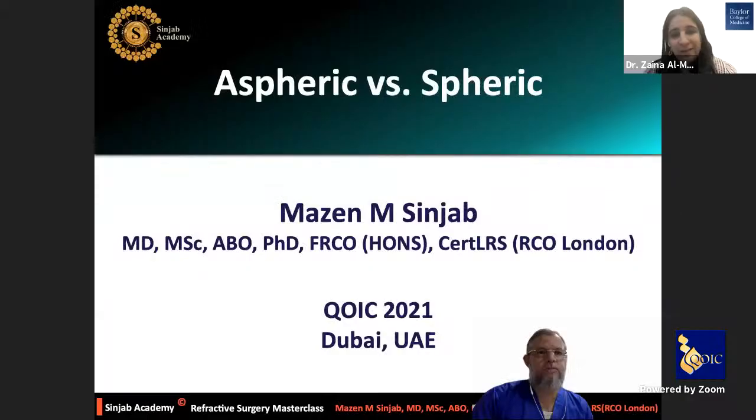Sure. So the power. We've looked at different studies to compare if you use total corneal astigmatism versus just anterior, in terms of affecting the power. And if you notice, on most patients that aren't post-refractive, for example, and that don't have large amounts of astigmatism, it's a minimal difference in power. So it doesn't change picking the IOL. The other aspect is obviously we only have 0.5 diopter steps of IOL power. So we're not that good in terms of that minimal difference in power. But we do think there can be a potential change in power for small amounts, in those outliers. But no, we're not good enough to take that into consideration. So I don't do anything different.